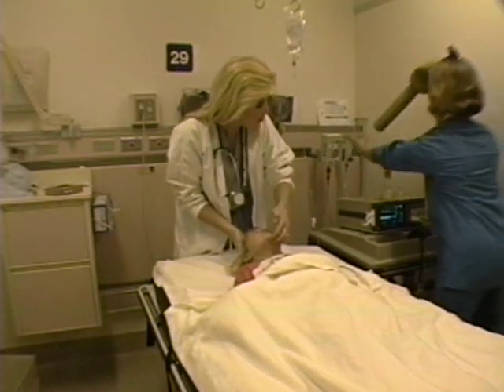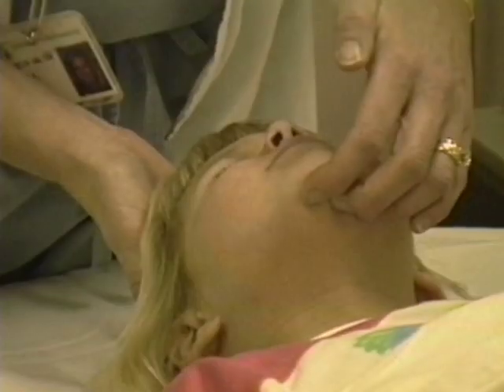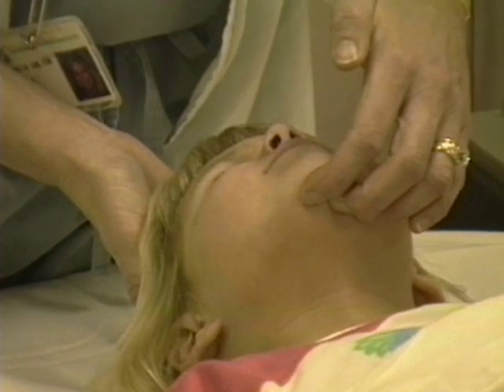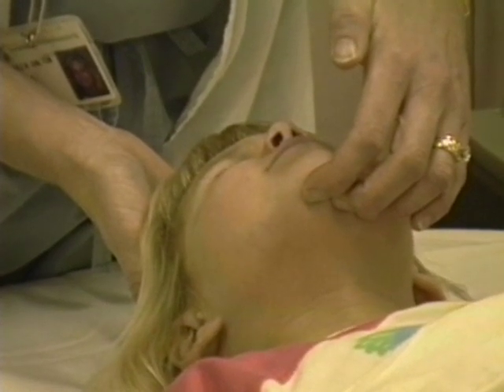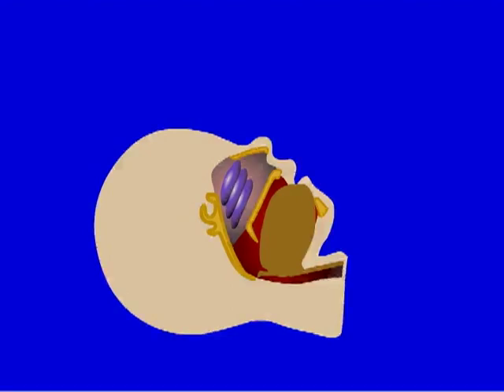The following maneuvers assume no cervical spine injuries. If cervical spine precautions are needed, use jaw thrust only and maintain a stable head and neck position. With the head in a relaxed and flexed position, the tongue and soft tissues tend to collapse over the larynx and cause obstruction. The oral, pharyngeal, and laryngeal axes are not aligned.